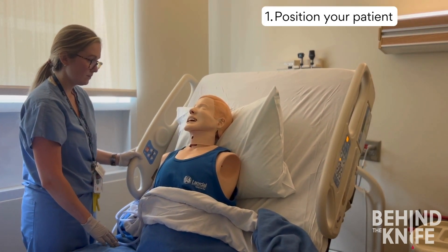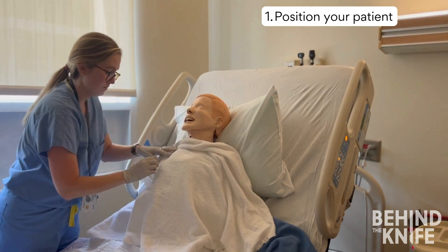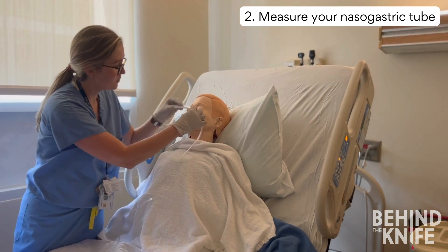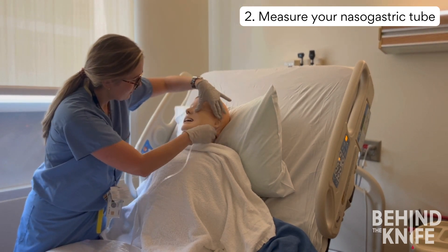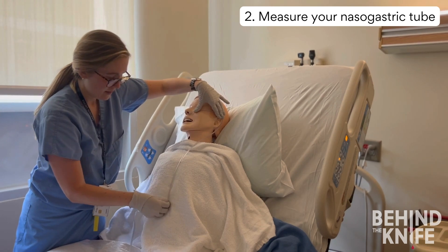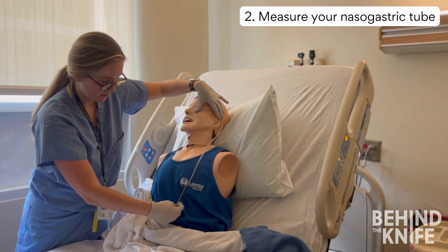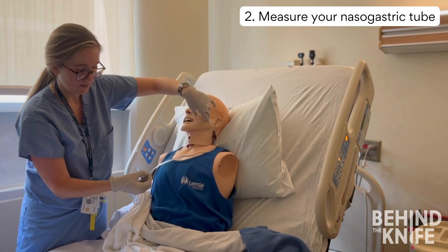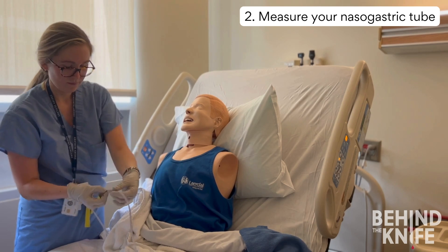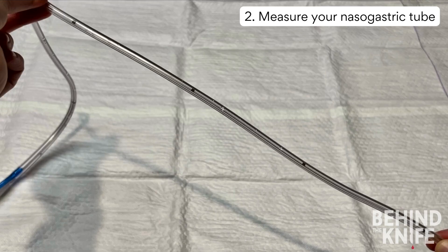Next, you'll position your patient and set up your supplies. This works best if your patient is sitting up as much as possible. You will need to measure the NG tube by placing the tip at the patient's nostril, bringing the tube around their ear, and then down through their midline over their stomach. This gives an estimate of how much tube you'll need to insert. Average insertion depth is around 55 to 65 centimeters for an adult. There are markings on the NG tube to help you track how much has been inserted.